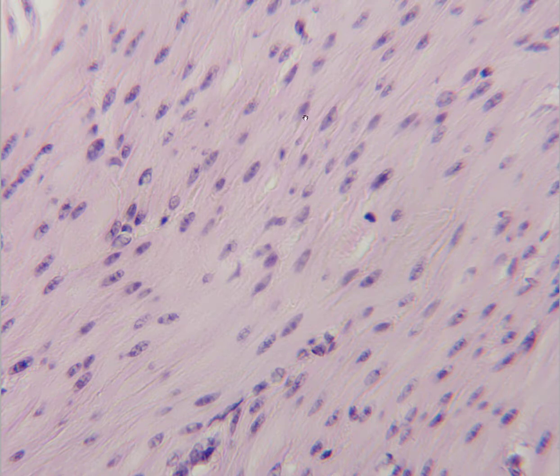However, in this case, you can see very nicely the tapered cells themselves, and you can actually see the nuclei, and they have this sort of oval shape, and you can see inclusions in the nucleus. So you see these inclusions that are not otherwise present when we look at dense fibrous connective tissue. So the smooth muscle is going to distinguish itself, for one, by the shape of the nuclei. They're not as long, and the cells have this very tapered appearance.